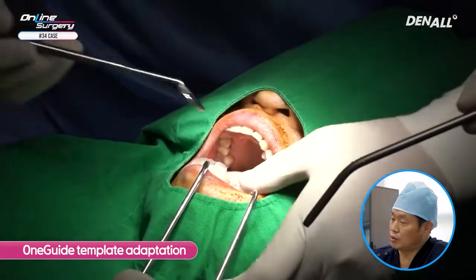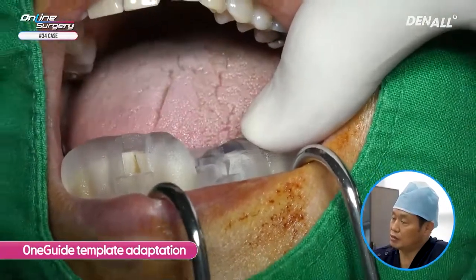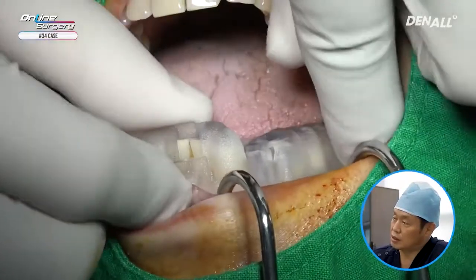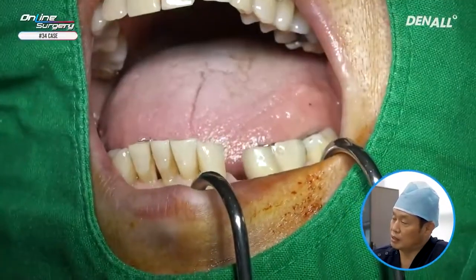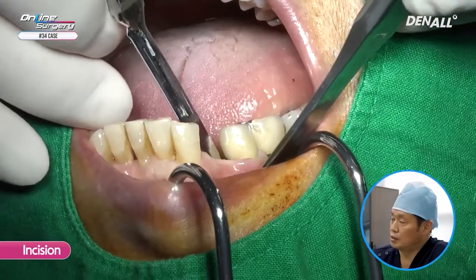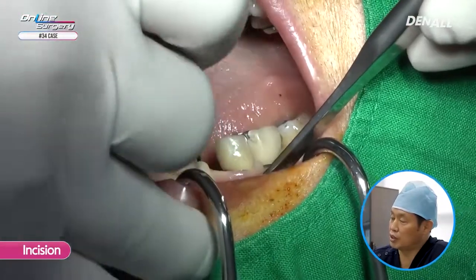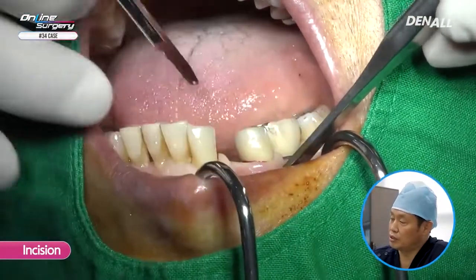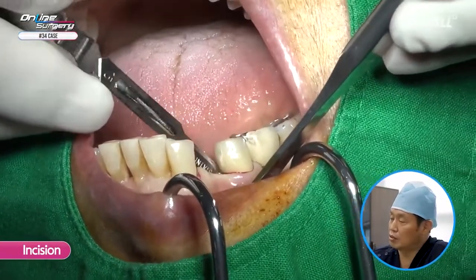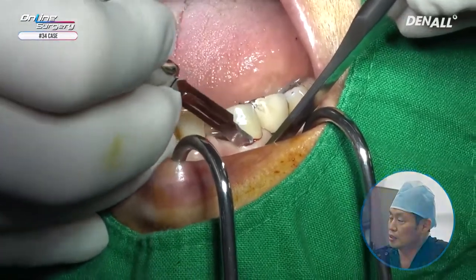I'm going to adapt one guide template to see if it fits well. As shown, I check once again whether it fits well in the area with the adjacent teeth. After implant placement, GBR is going to be done on the dehiscence defect, and I'm going to make an incision to reflect the flap first. And I'm going to reflect the flap and then adapt the one guide template once again.